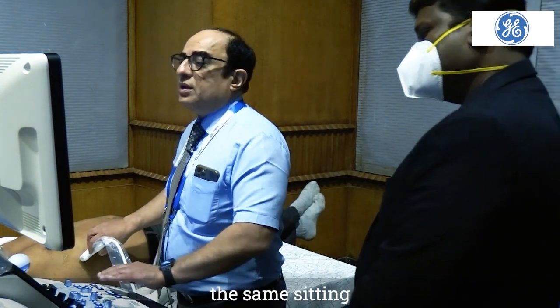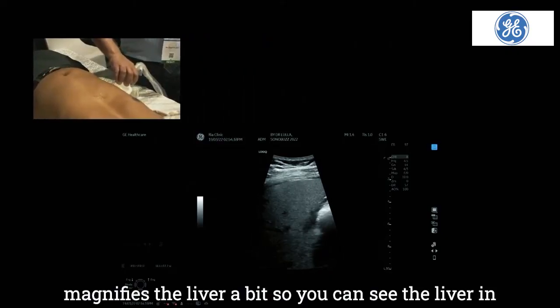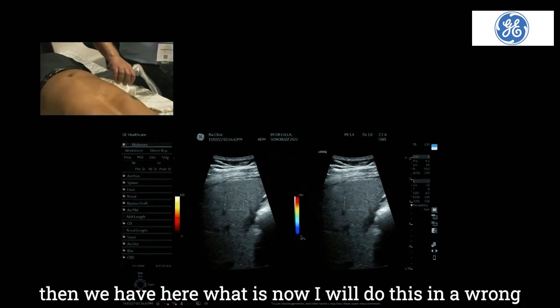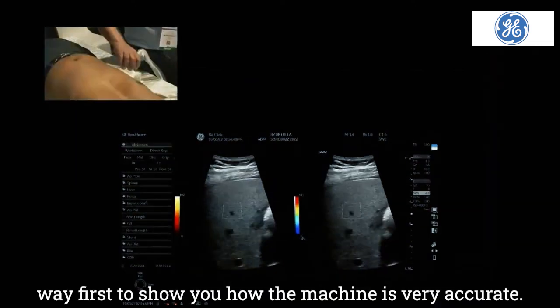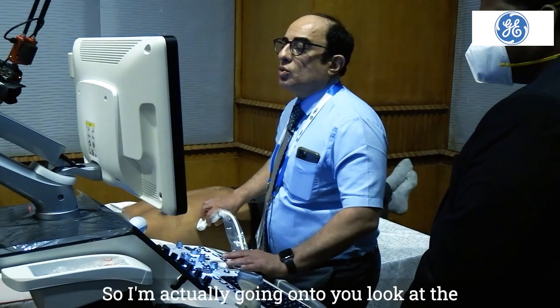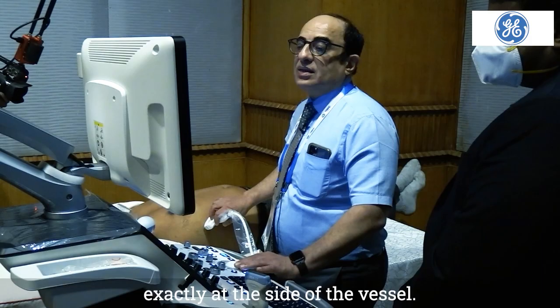At the same sitting, we have a preset for the shear wave here which magnifies the liver a bit. So you can see the liver in a much better way, and you can see the surface. And then we have here what is... Now I will do this in a wrong way first to show you how the machine is very accurate. Breath hold, please, breath hold. So I'm actually going on to... You look at the number of vessels there, and you will see that exactly at the site of the vessel.